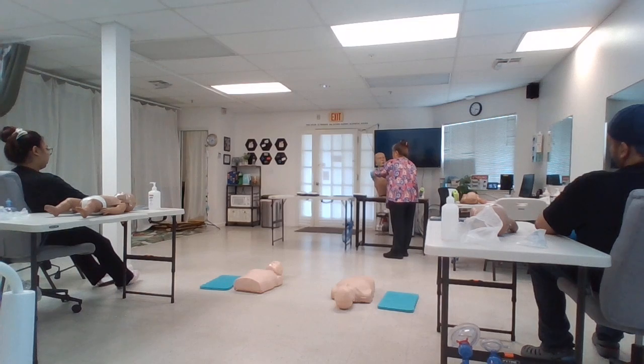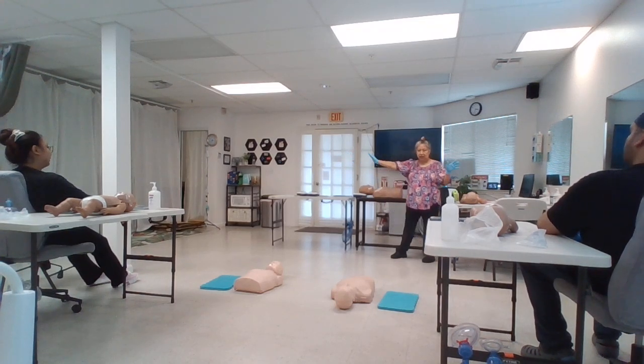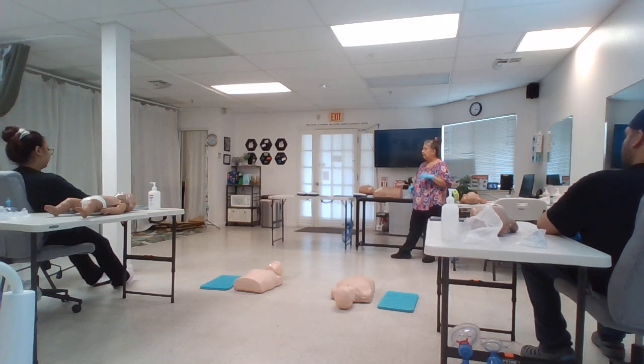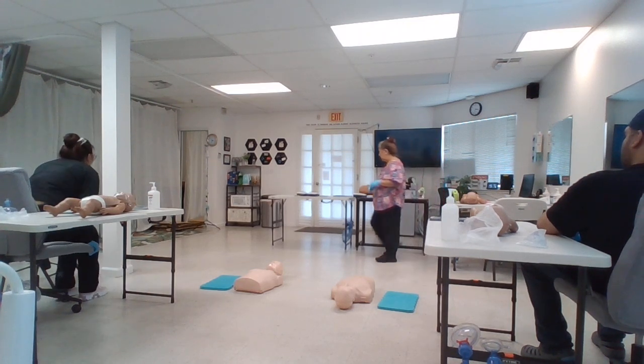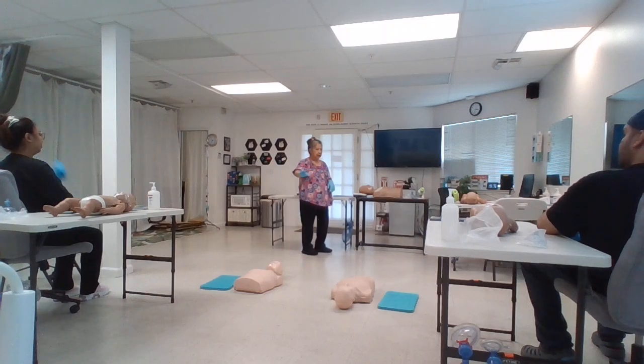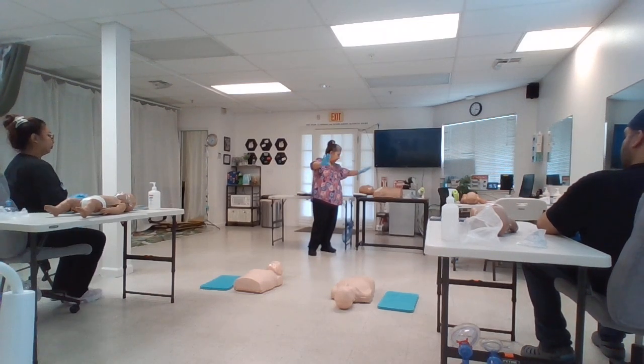Do not touch the patient, analyzing heart rhythm. Now when you hear analyzing, you have to say clear immediately. Okay, so I'll just make sure everybody's clear. Shock advised. Do not touch the patient. Everyone clear. And you keep saying clear. Press the flashing shock button. And again, before you push the shock button, say clear. Press the shock button.